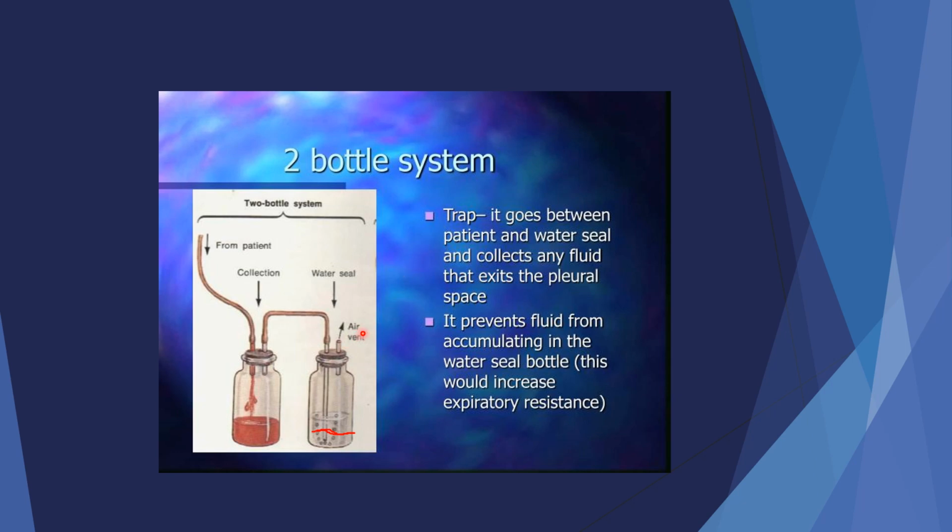Right? There's risk. So there's no control over it. So you can hook this to suction here, and it'll start bubbling here, and it'll start sucking everything out. But there's nothing regulating that, right? And what this can do is it can cause trauma within the chest, trauma such as hematomas or tissue damage around those holes that we saw in those chest tubes and everything.